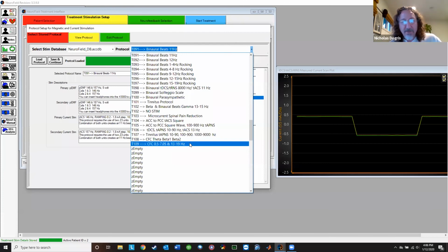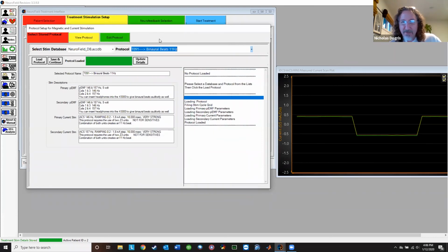All right, those are protocols from 2 big databases.